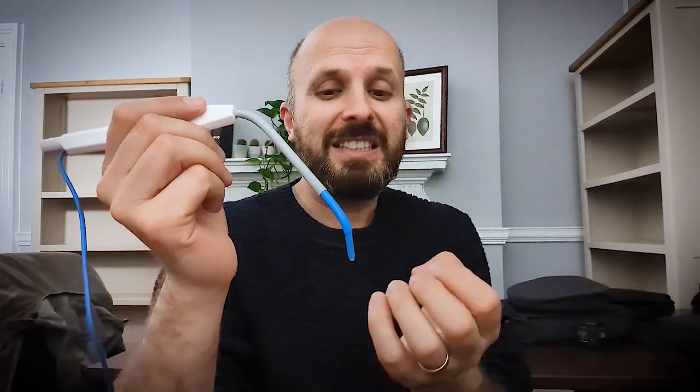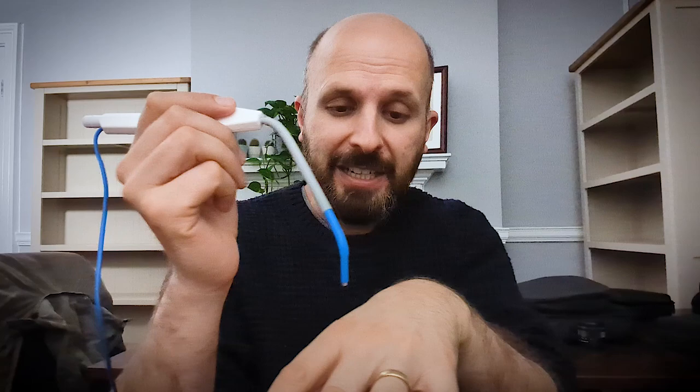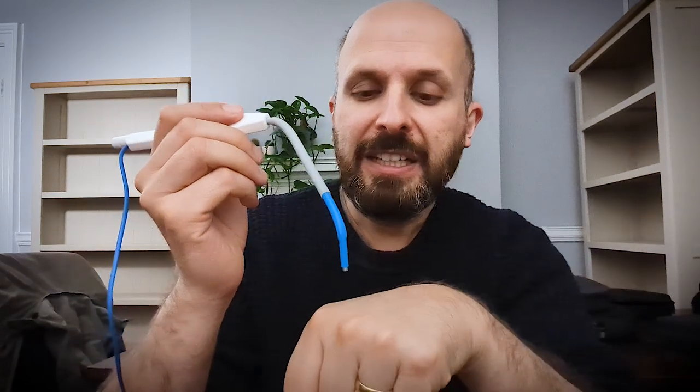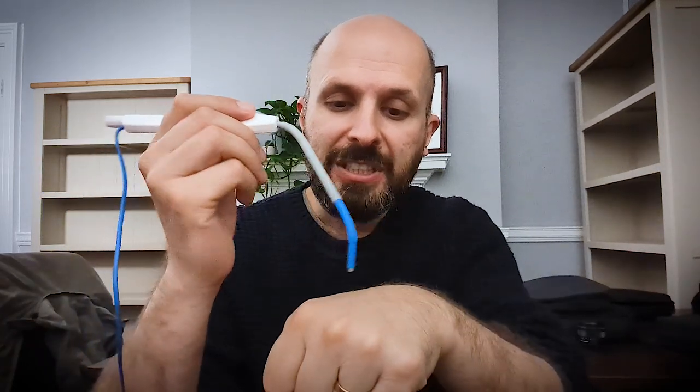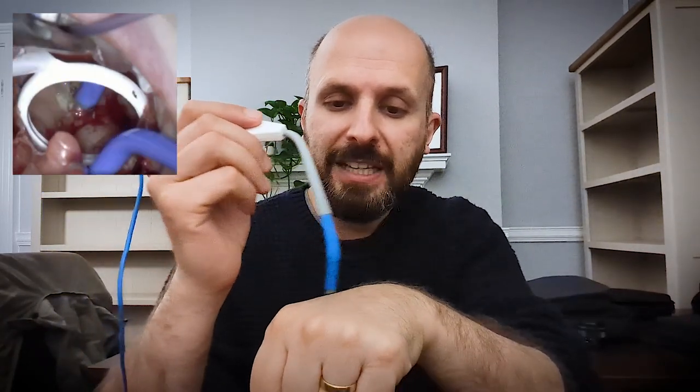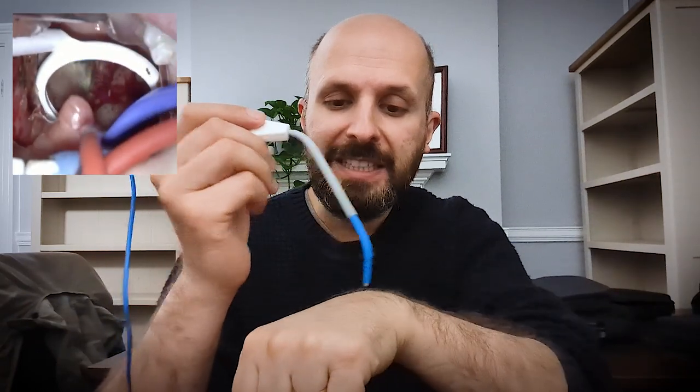A lot of people mistakenly press this onto the adenoid and slowly cauterize it, but this is not a cauterization technique. Unlike some of my other videos where I cauterize or ablate tissue, here you're ever so slightly hovering above the tissue. The electrode is passing energy at such a high rate that it's vaporizing the tissue directly underneath it, and as it's vaporized the suction removes it. You can't stay in one place too long or the tissue gets charred and goes black — it's very hard to remove black charred tissue from the back of your nose.